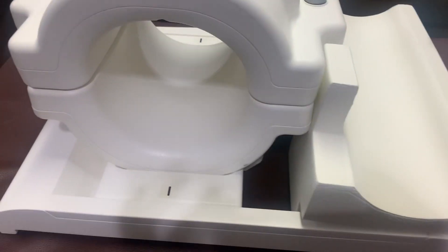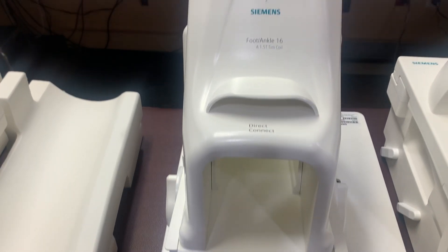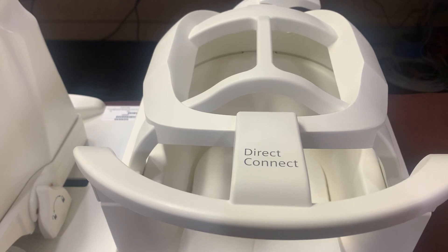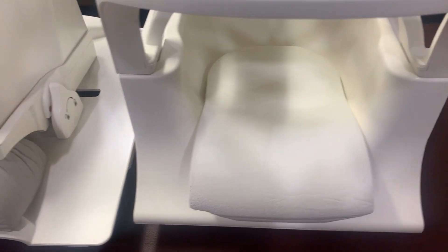Now you have the knee coil and the foot and ankle coil, as well as your brain, cervical spine, or thoracic spine coil.